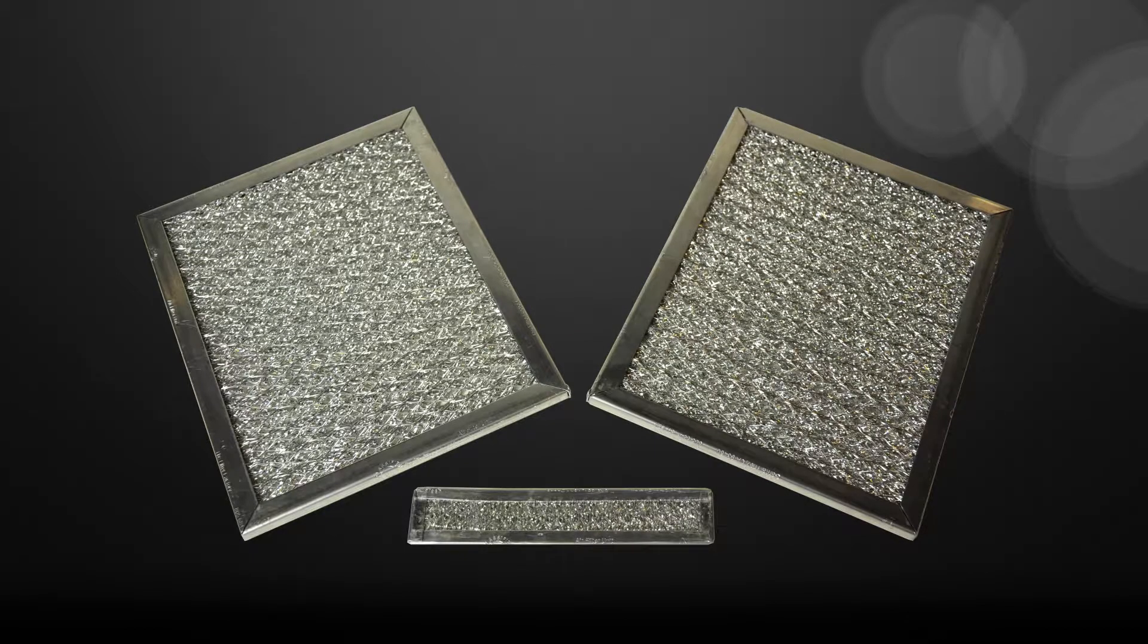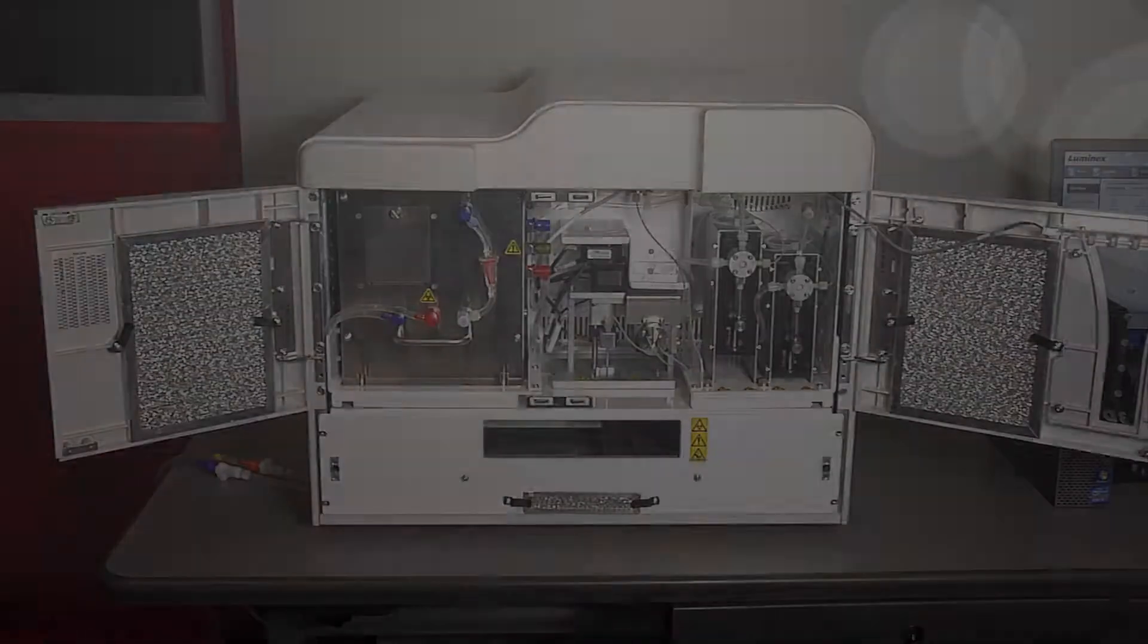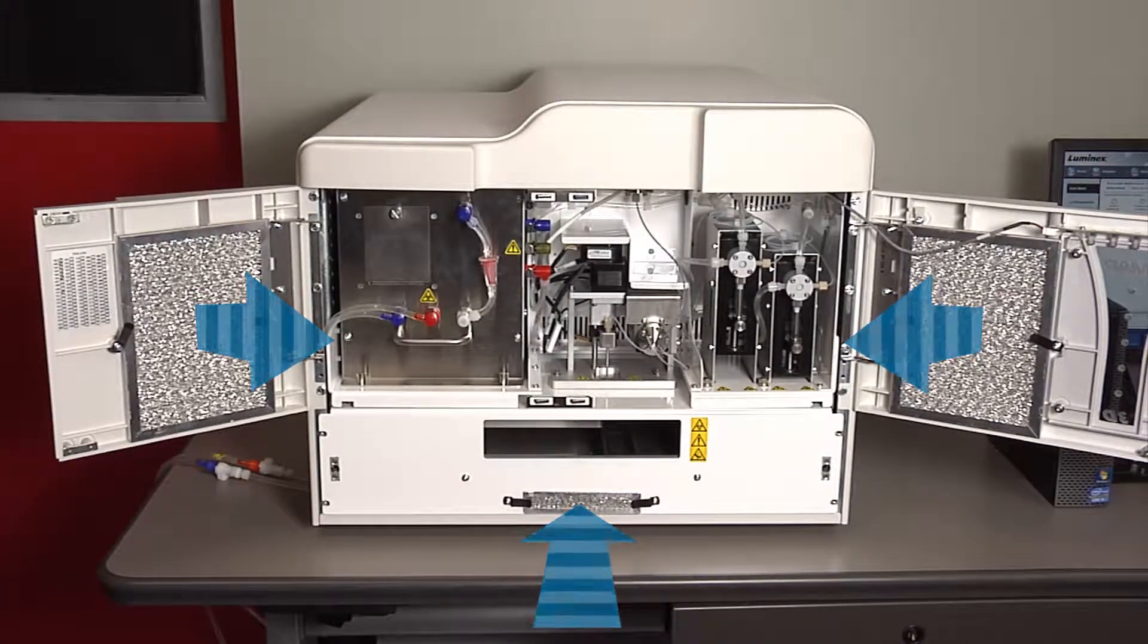Here's how to clean the air ventilation filters on the FlexMap 3D. Each filter has at least one imprinted arrow on its metal frame. This arrow indicates the direction of the air flow. Filters should be installed so that the arrows are in the correct locations and point in the correct direction.